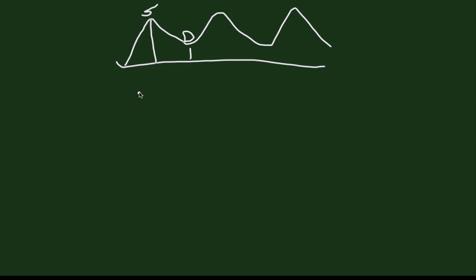So the easiest way to evaluate these waveforms is to look at the systolic to diastolic ratio. And it does just that. You divide systolic flow divided by diastolic flow. And in general, after 30 weeks gestation, anything greater than 3.0 is considered to be abnormal. This is really a very crude measurement, but certainly easy to do and quick to do.